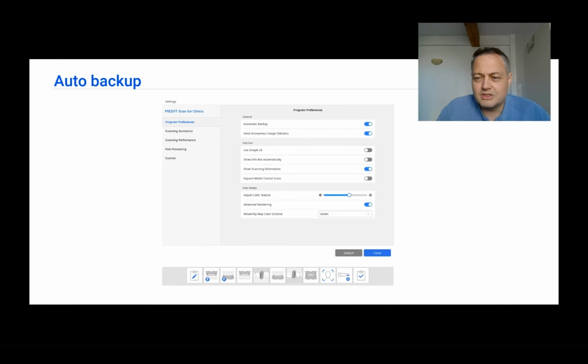After you scan a part, stop, go on the upper left, and you are going to find a save button. Press the save button, and what this does is back up even the stage that you are working on directly on the hard disk.